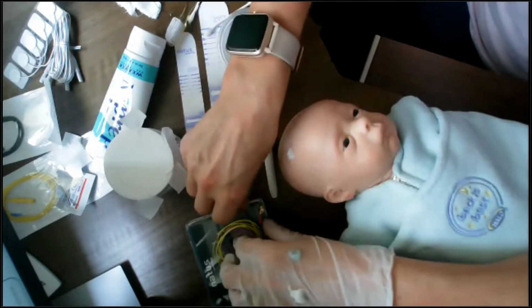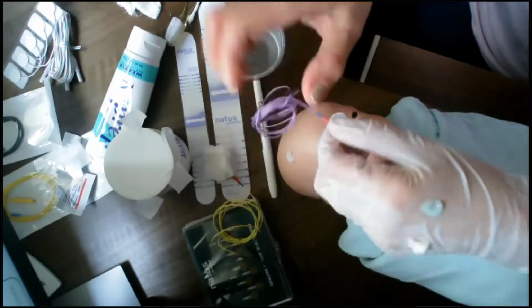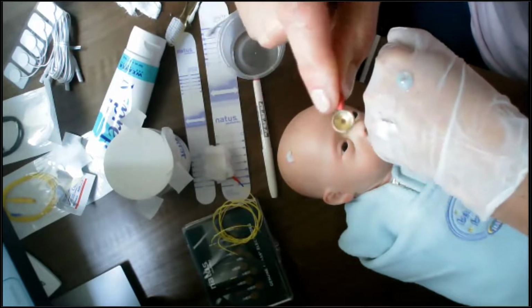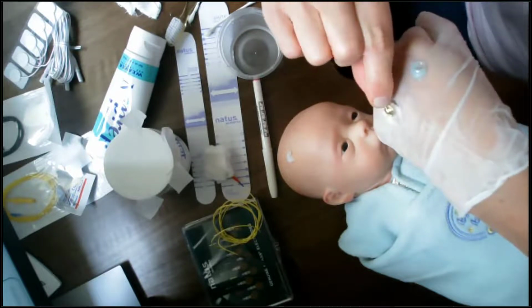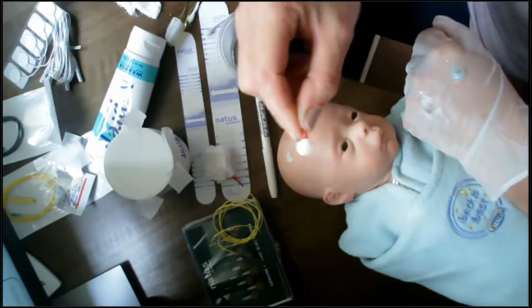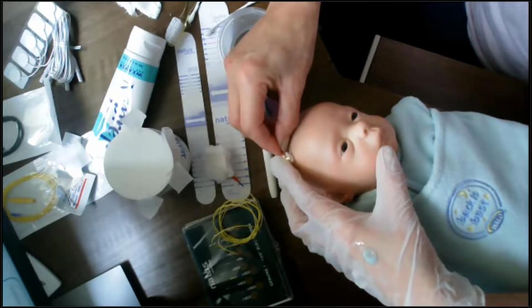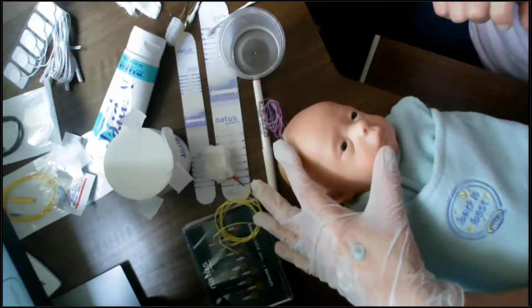Okay, I'm going to take my EEG cup electrode. I'm going to scoop, watch this, so here's my electrode. It's got, you can see, a divot inside it. I'm going to scoop a big bit of paste until my cup is really full of paste. And then I'm going to place it gently but firmly down onto that site.